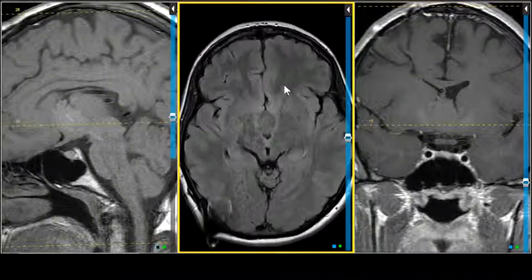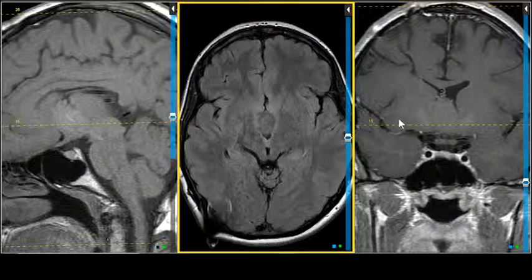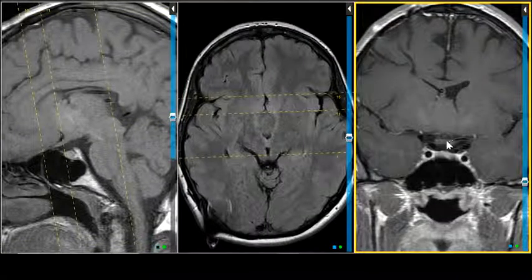So they're going to want to know, how did they do? Well, we got to know what it looked like beforehand, but they probably removed some, but they do have decompression, at least of the ventricular system, and there's no transependymal spread. Okay, so there's been some treatment here that's at least been effective. Sure. Getting the old scan, as usual, is critical. The optic apparatus is spared.